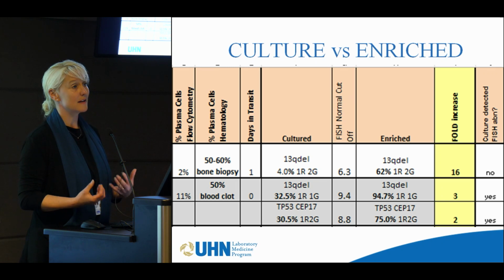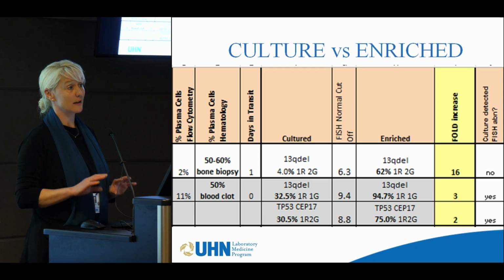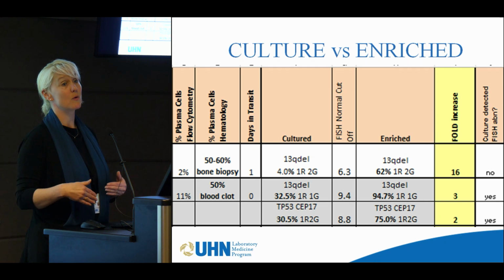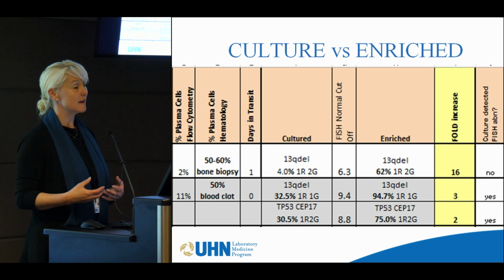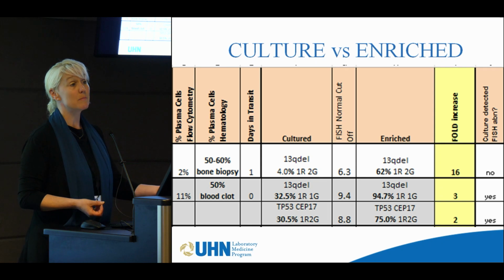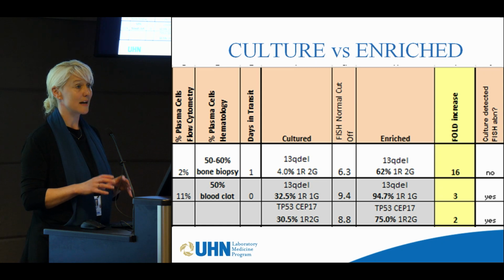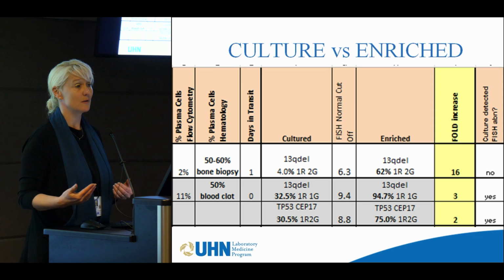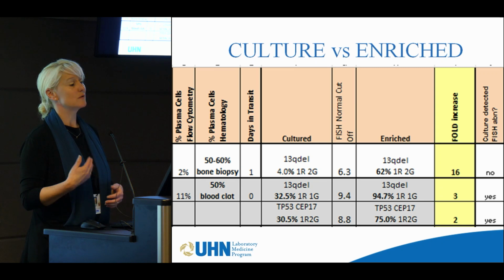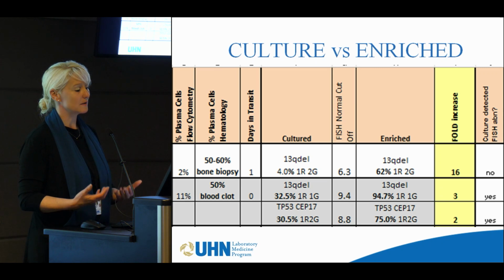So we suspect that the aspirate, and we only work with aspirates in hematology, or the hematopathologist will report either on a biopsy or an aspirate, and the current guidelines recommend that they report the higher percentage of plasma cells. But again, because of the focality of multiple myeloma, that bone biopsy sample he or she is looking right at that area, versus we're receiving an aspiration. So it may be hemodiluted, and you can start justifying why the percentage we saw was so different.